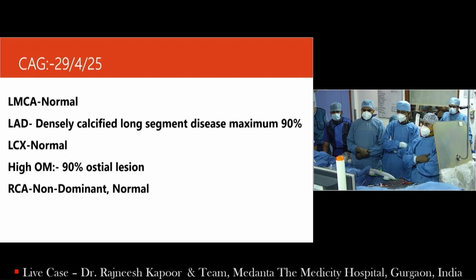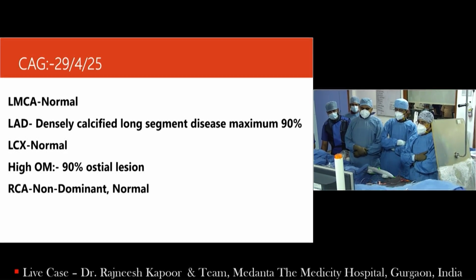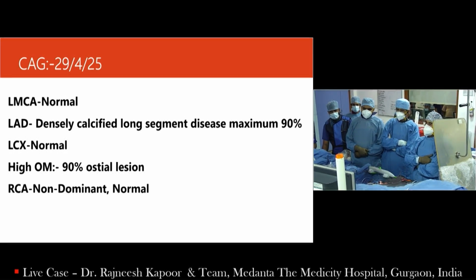He hails from a city near Delhi, so he got his angio done there. So this is the angio which we have done today, but we saw the angio yesterday, and this is the angiogram. This is the RAO caudal view. Look at this. LAD is very densely calcified, and I'll show you an AP cranial view.